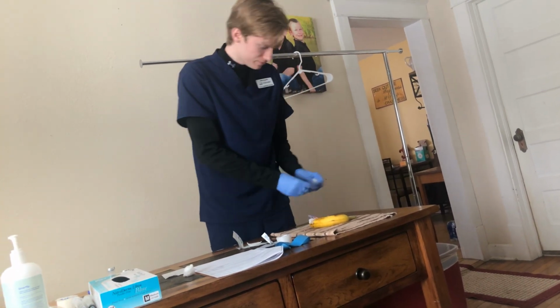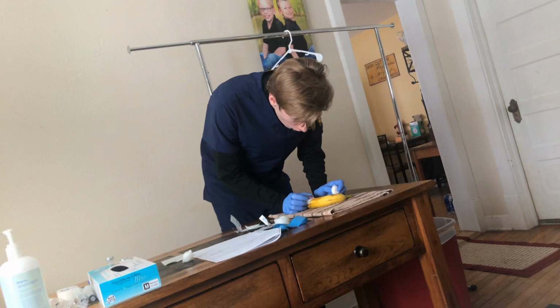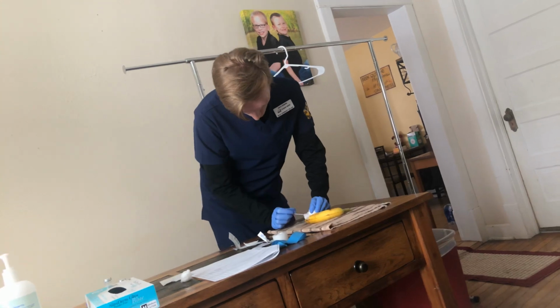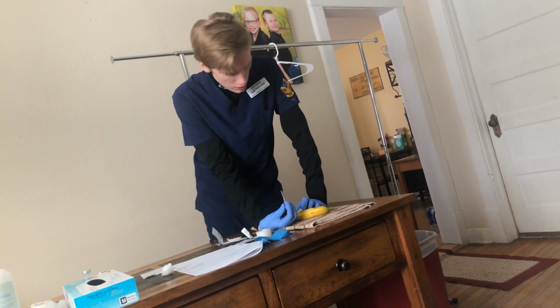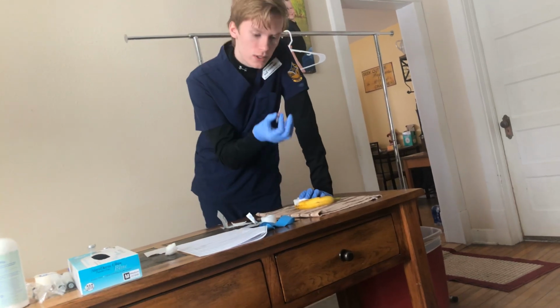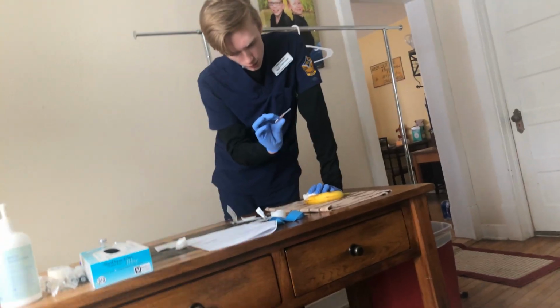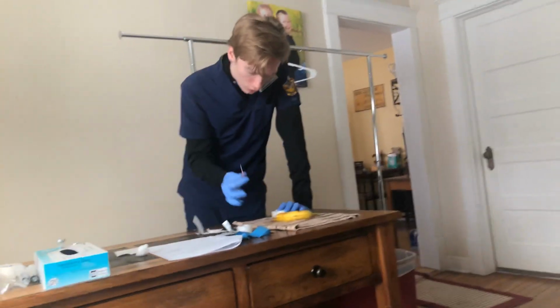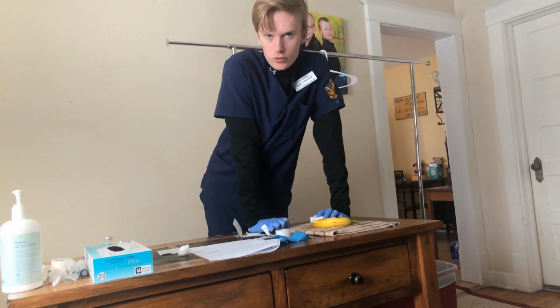Now that that is done, get this, my alcohol, on my cotton ball, and then pull out with one hand slowly, and then apply pressure to the site of which the catheter was in for about 2 minutes, just to stop the bleeding and get some clotting going. I'm also going to inspect the catheter, make sure it's intact, make sure there's nothing wrong with it. After I have inspected the cath and everything is good, nothing is abnormal, we are good to dispose of this in the appropriate container. Again, hold this for about 2 minutes.